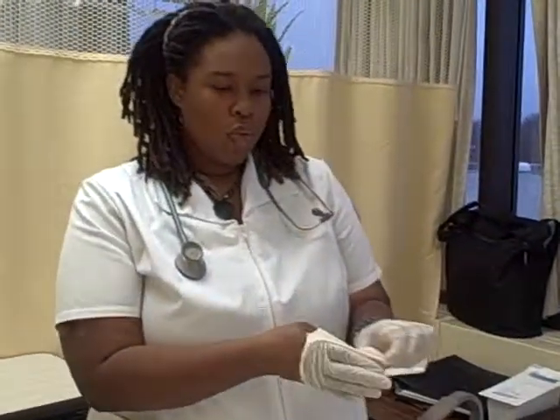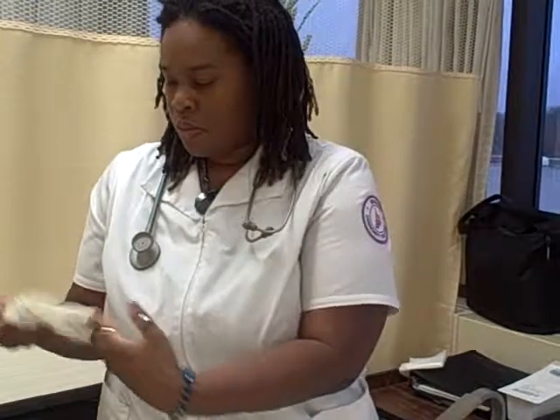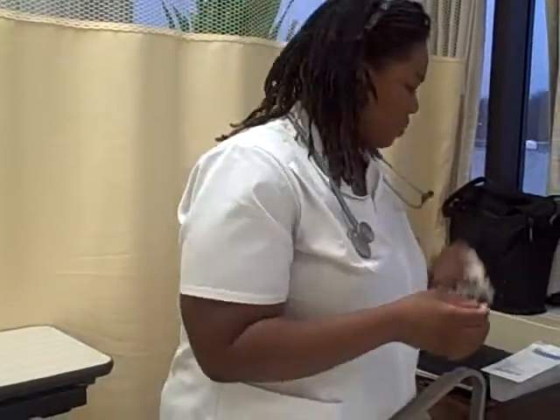I'm going to remove my gloves and discard. And I'm also going to wash my hands and make sure to document the findings in today's procedure. That would be the color, consistency, and the amount of the gastric contents on my I&O chart and the flow sheet and the nursing notes.